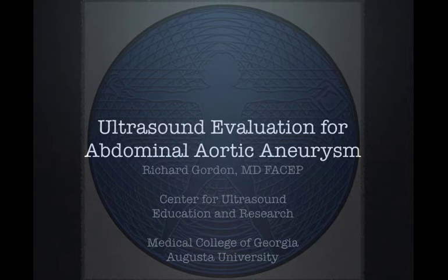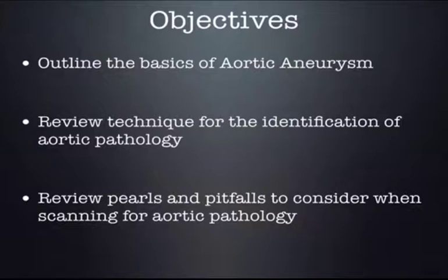Welcome to the presentation on ultrasound evaluation for abdominal aortic aneurysm. The objectives of this presentation are to review the basics of aortic aneurysm.